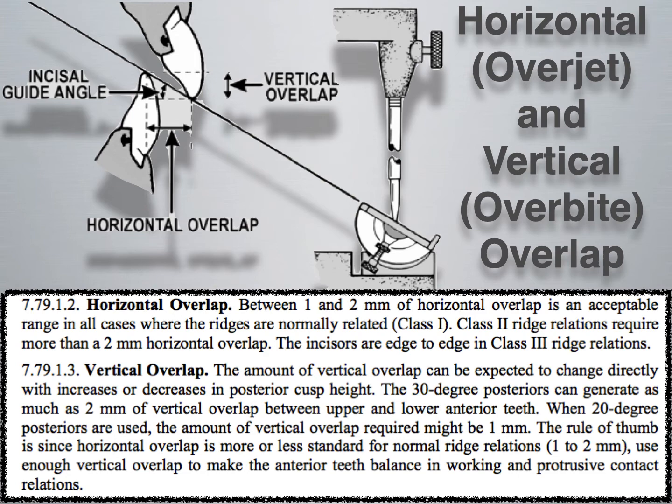Now, as I discussed previously, overjet and overbite. A good way to remember overjet, one of my professors taught me, is to imagine a jet flying horizontally across the sky. Overjet is a horizontal space, right? Although that doesn't necessarily make sense when you think how a jet flies, it flies up vertical or horizontal, but overall, from one point to another, flies horizontal. So it's a good way to remember it. And overbite is your overlap, right? How much does your maxillary incisal edge cover your mandibular incisal edge? That distance is your overbite.